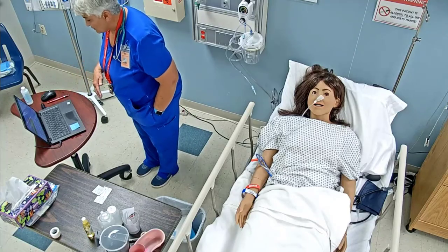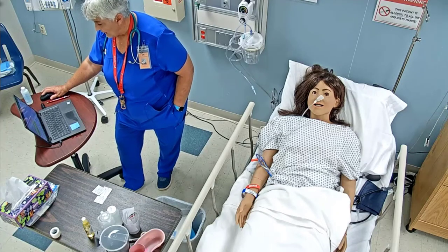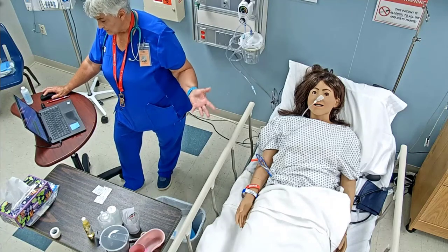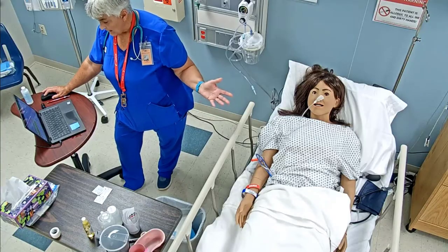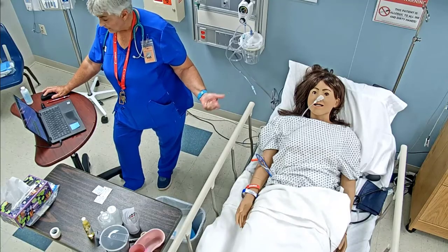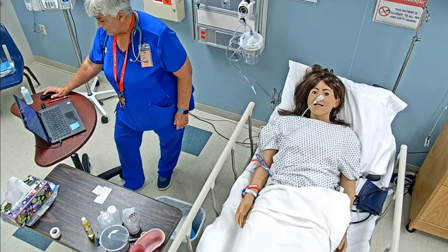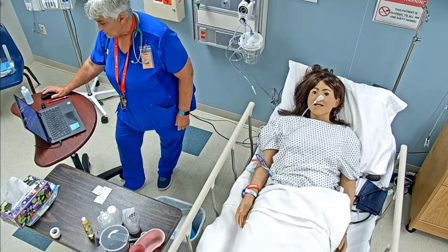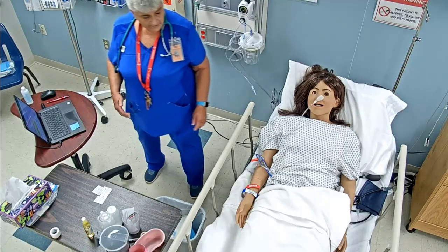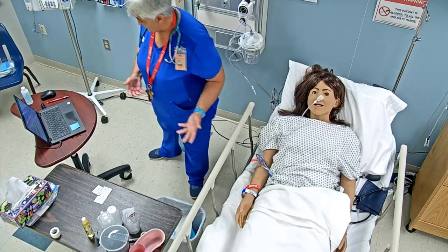So I've checked the doctor's orders. Again, I'm going to be looking in the chart to see if there's anything that I need to report to the doctor, or if there's anything that says we don't need to do it, or if I need any extra help in there when I do this. My patient's been very cooperative, so we don't need that. I'm going to check the policy and procedure, and that's something we do with everyone. Again, we're going to be looking at do they have any learning needs, and what types of learning needs? How do they react, and what kind of teaching?